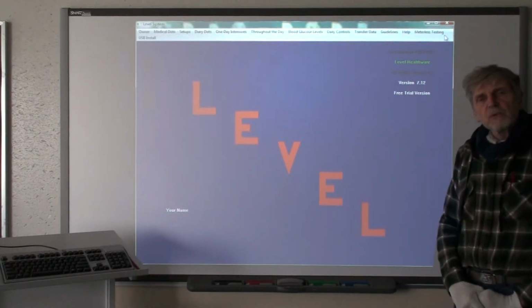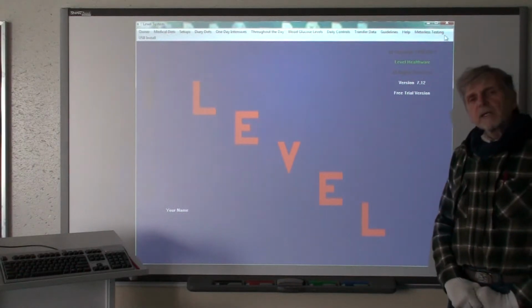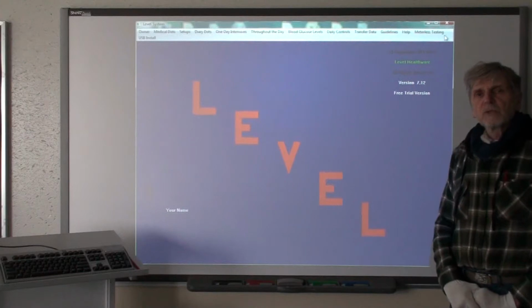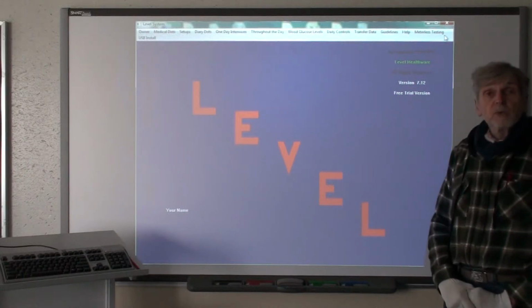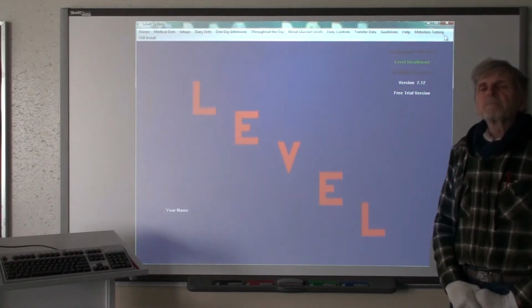And also, if you tell your diabetes caregiver the location of that FTP server, then they can also have access to look at your data at any time, and even while you're also looking at it yourself. In fact, you can both look at it simultaneously and have a phone conversation about it.